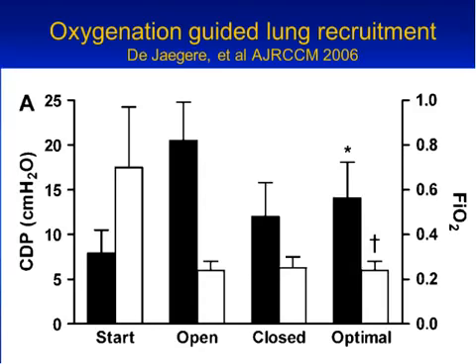So the second column labeled open, the FiO2 is low, the distending pressure is fairly high, about 20 centimeters. And then they will stepwise reduce the pressure to try to find that sweet spot. So it's important to not leave the distending pressure at the maximum that was needed to open the atelectatic lung. Remember that once you open the lungs, they become more compliant. And once they're more compliant, they need less pressure to keep open, and that's what you're trying to find.